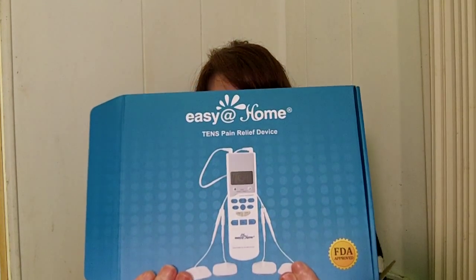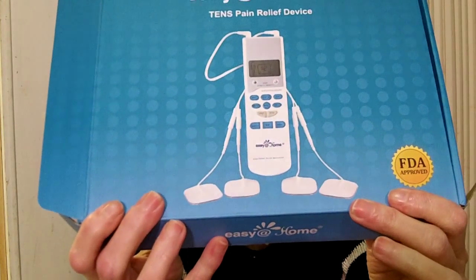Hi everyone, my name is Lori, I'm 54 years old and I live in Florida. Today I want to talk to you about the Easy@Home TENS pain relieving device — this one is FDA approved. I have sciatica and sometimes my back really hurts, then it runs down my right leg, which is very annoying. I was looking for something to help because a lot of the rubs and things weren't working all that well.